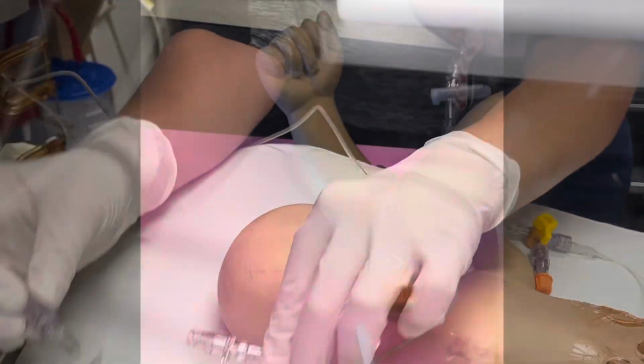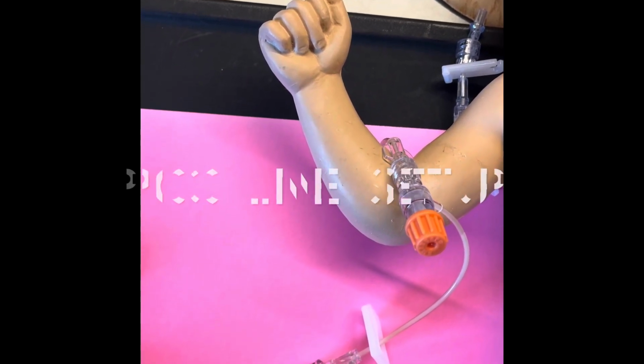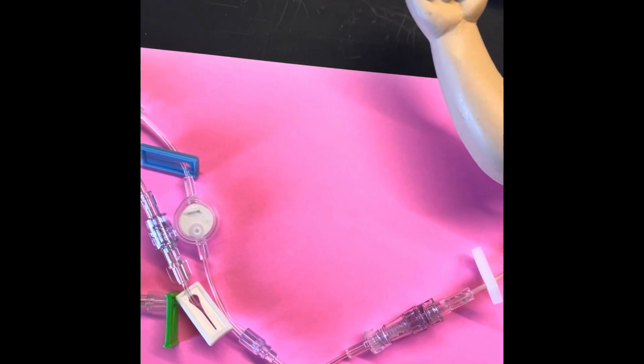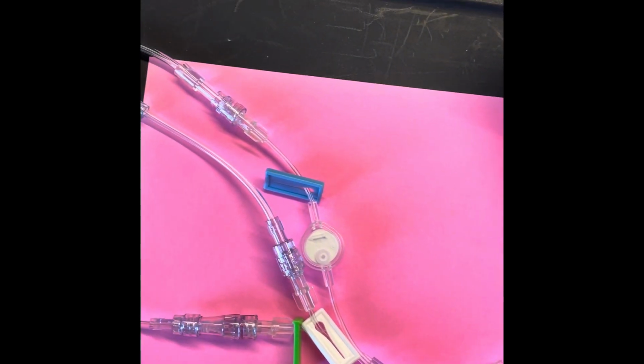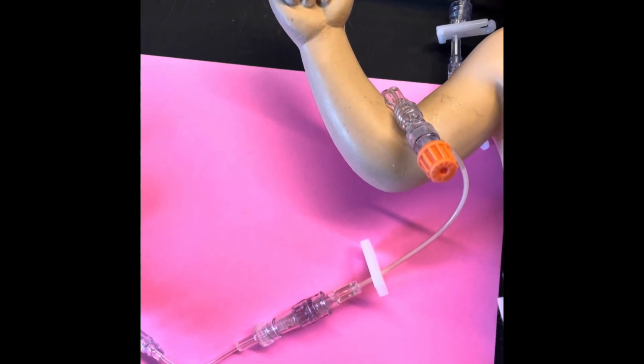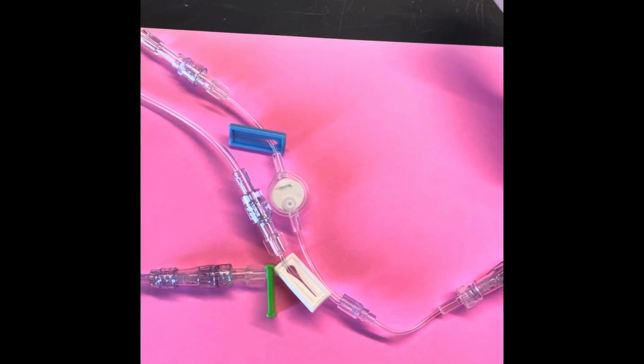Our PICC lines will have a T connector attached. This is part of the setup and does not get changed out. You can add a swab cap to the microclave on the T connector that's closest to the baby. This is the setup. PICC line down to T connector has a microclave, and then your IV fluid would be attached.